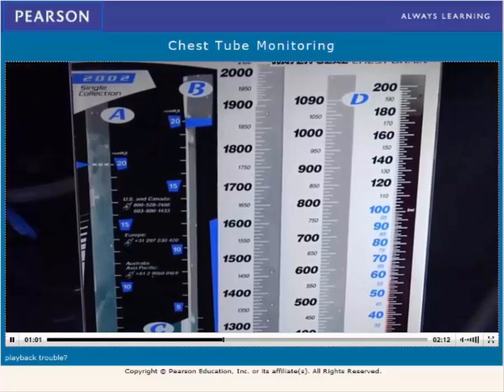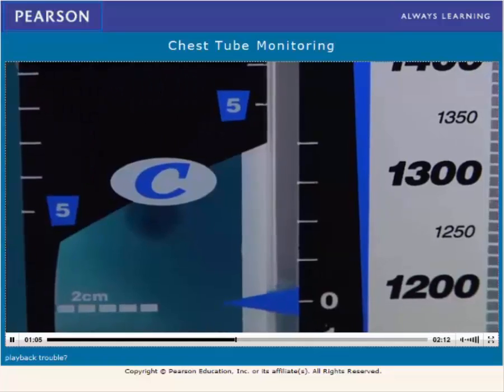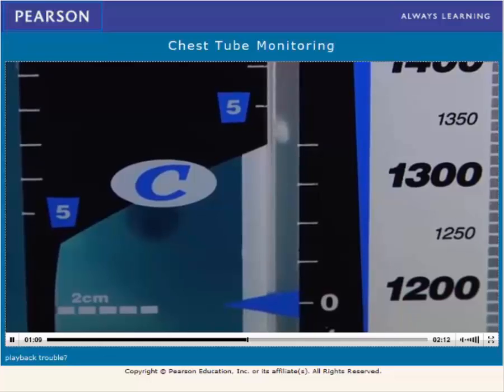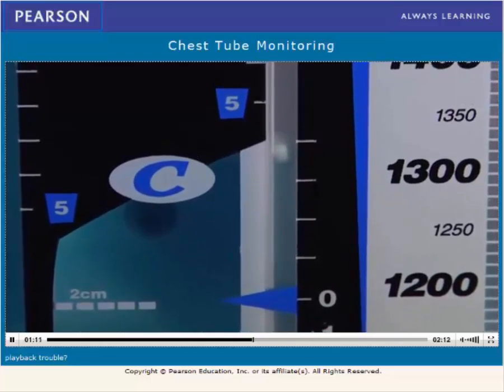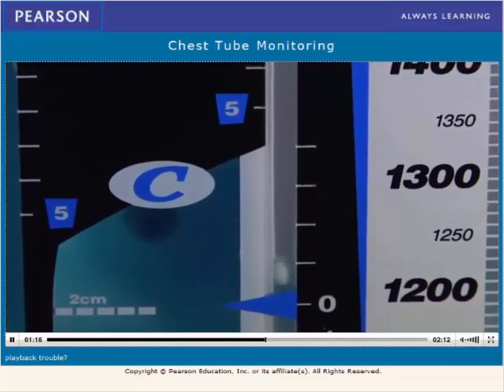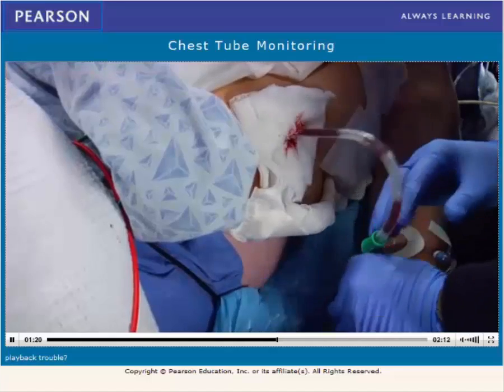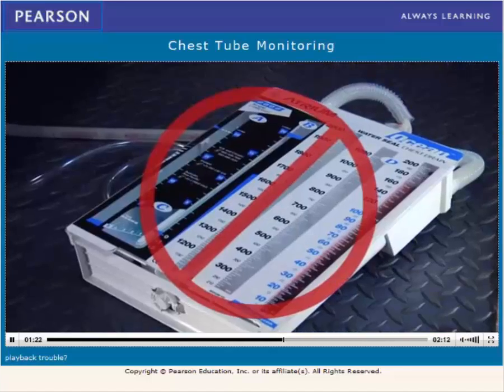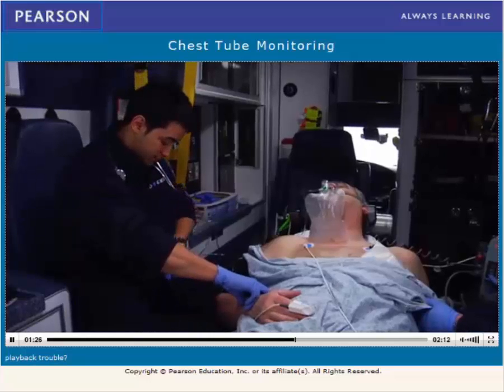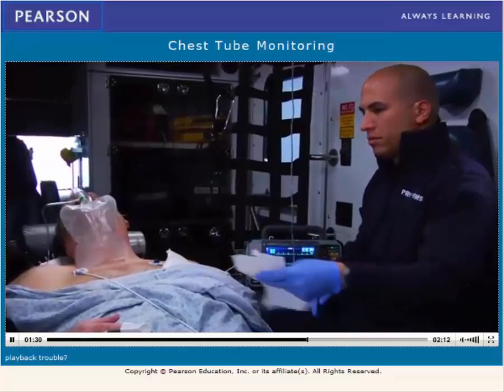The second chamber creates a water seal, allowing air to escape the chest and not re-enter. The water in it should undulate or tidal with respiration due to pressure changes in the pleural space. The fluid level should rise on inspiration and fall during exhalation. If the fluid is not undulating, check for kinks in the tubing or that the system has accidentally tipped over or is no longer below the level of the chest. If the fluid in the middle chamber is bubbling, check for air leaks and repair or replace the system.